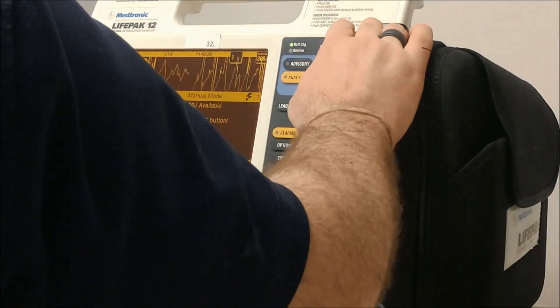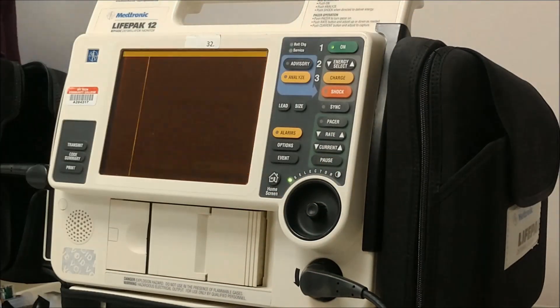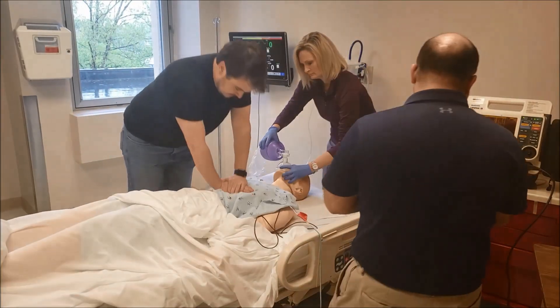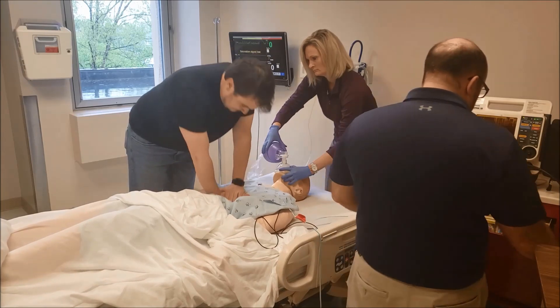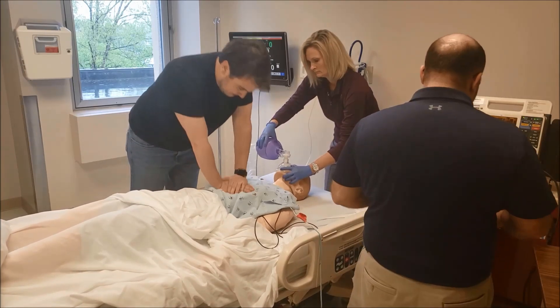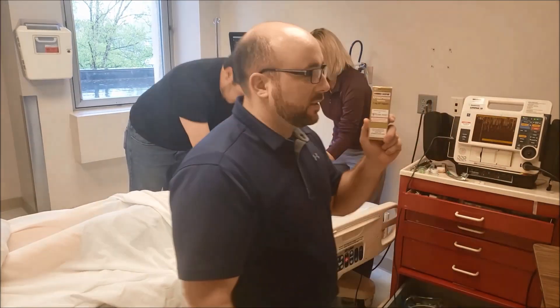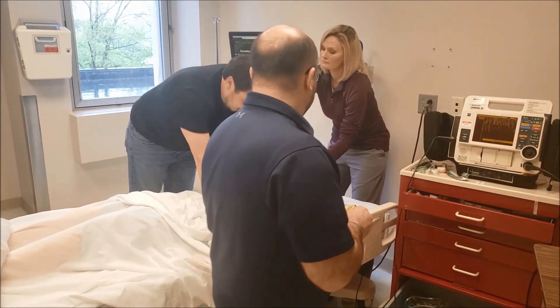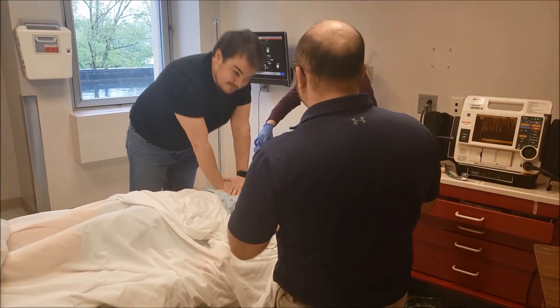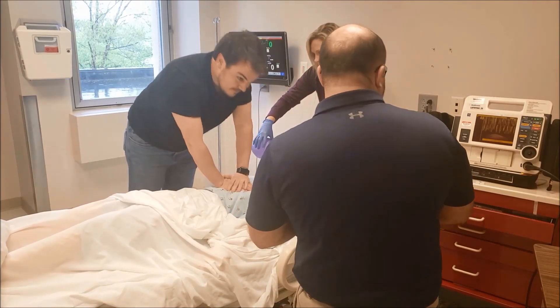Clear the patient — everybody clear, shock delivered. Resume CPR. Now we're going to deliver our first vasopressor — epinephrine one milligram. We have a patent IV, so epinephrine one milligram will be delivered with a rapid flush. Our fluids are wide open at this time. One milligram epinephrine delivered.